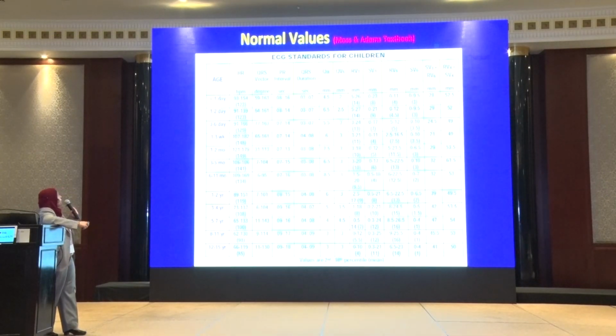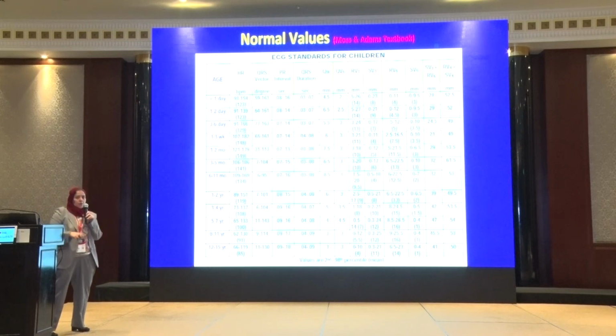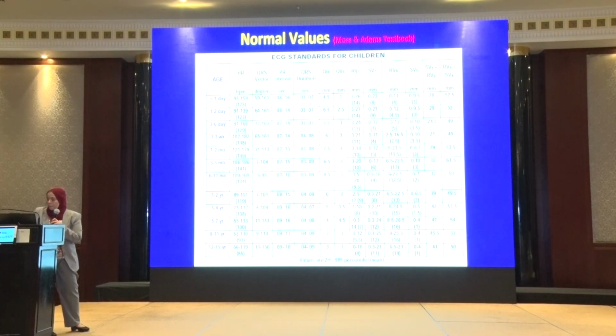This is the most important thing, that is the normal values. As we have many normal reference values in the labs and in everything, in the ECG also we have some normal values.